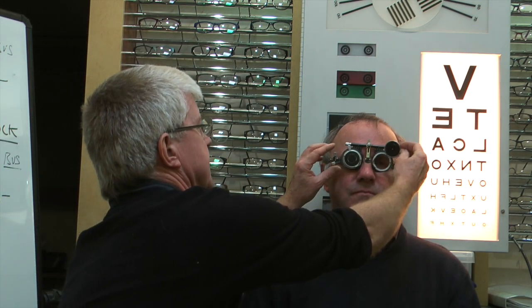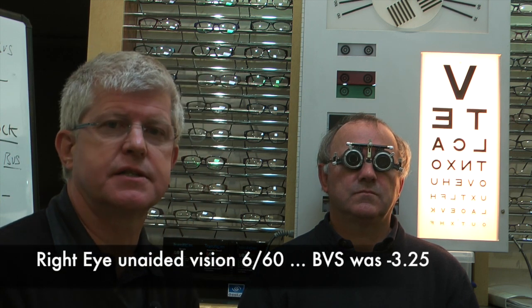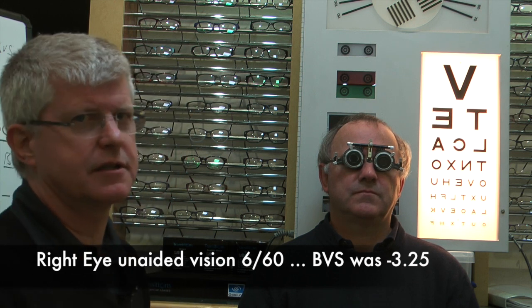So I'm just going to put the pinhole in. We were seeing 6/18 — how does that affect your vision? That's a lot better, I can read the top five lines easily, and pretty much down to the bottom but one line. With the pinhole we know that he has refractive error, because the pinhole has brought him right down to almost the bottom — he can read 6/7.5 with the pinhole. So we know he's got refractive error and glasses are going to help him. It's just a good little test to do.